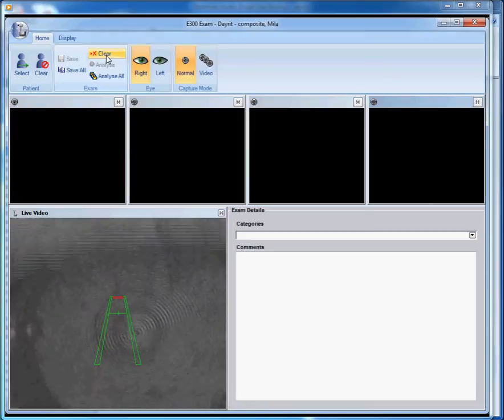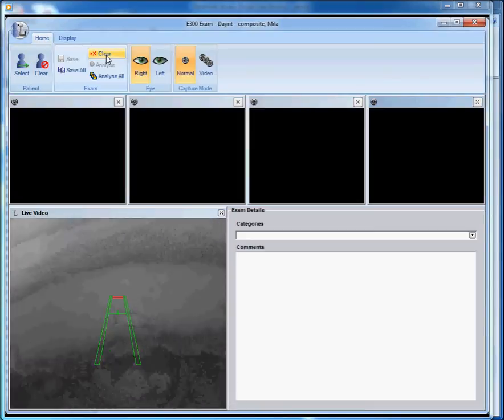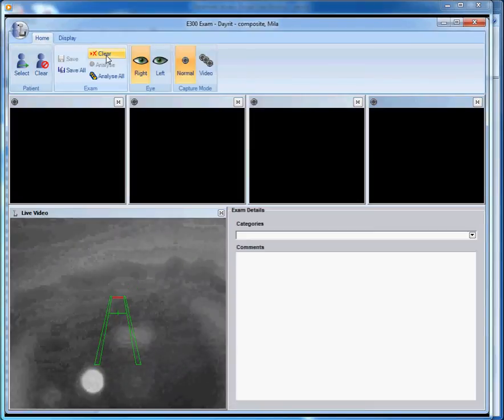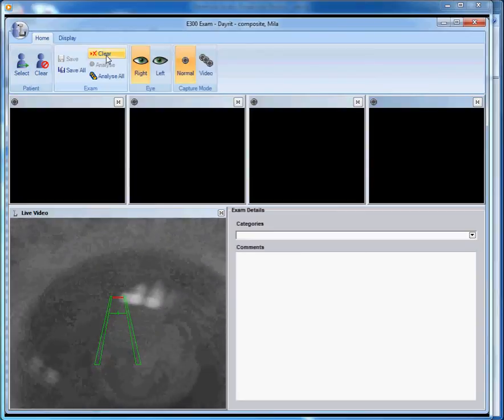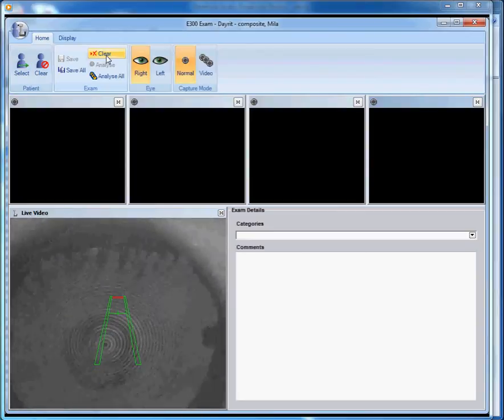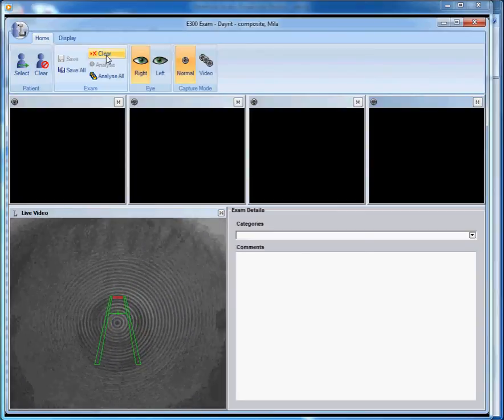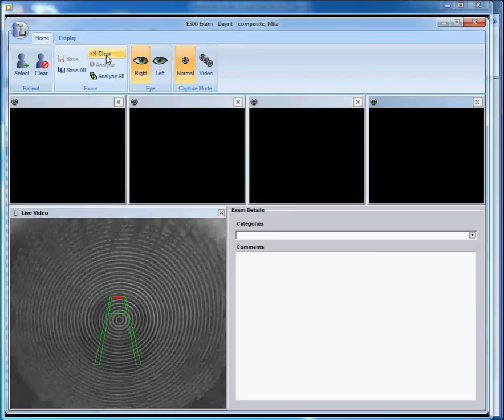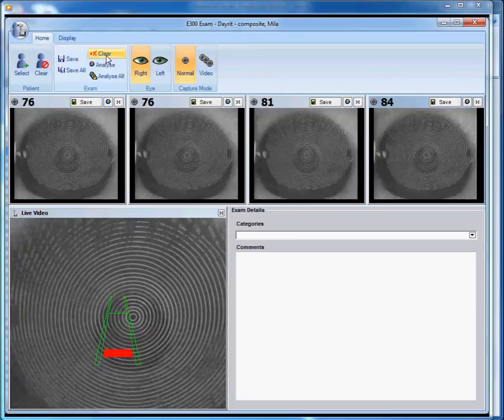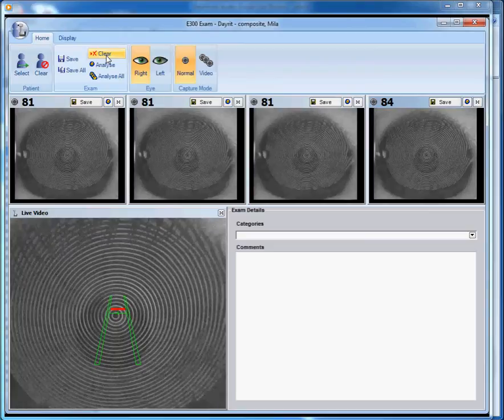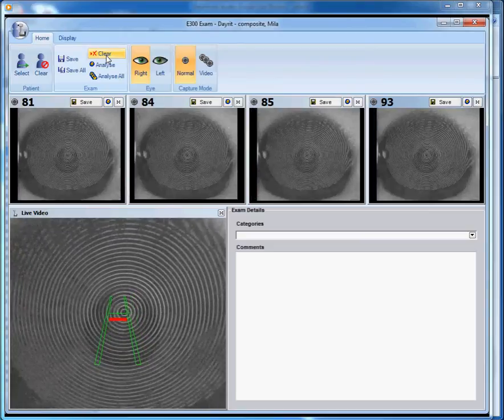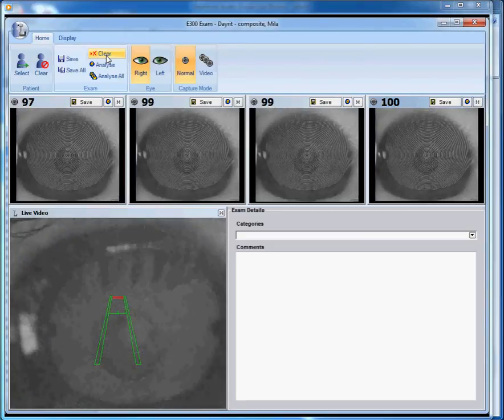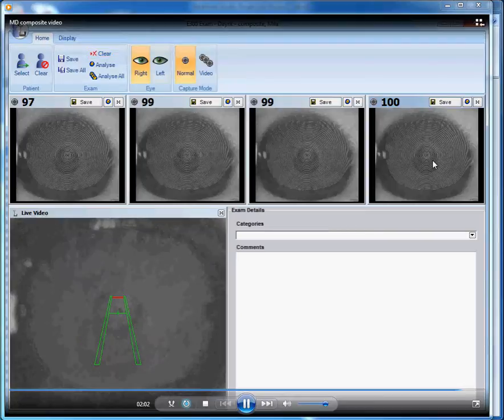Having the patient look down is the trickiest of the bunch because we need to pull the lid back. In order to move the cone close enough to take an image, the finger has to be out of the way, and that can be slightly tricky to do. As long as the eye isn't extremely deep set, you should be able to push the cone close enough to take that image with the patient looking down.